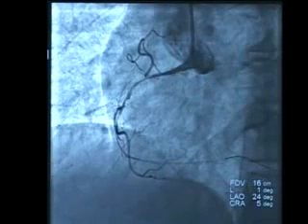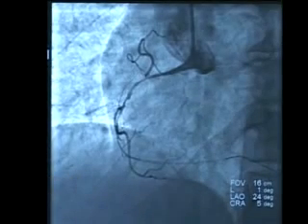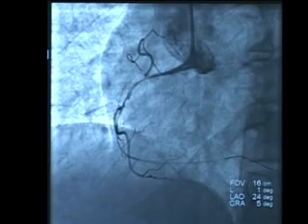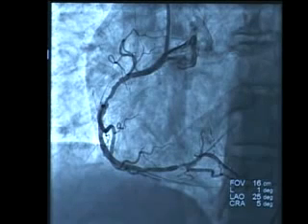That's after one pass of the export catheter. So the first picture's there, the second picture after one pass of just the clot, and then we made 2 more passes with the export catheter and one inflation with a balloon in the beginning of the artery. And that's how we ended up with this. And now we're going to put stents in this artery. So we'll put the 3/0 distal just at the crux. This is 3/0 by 15. And we're going to put that right about there.